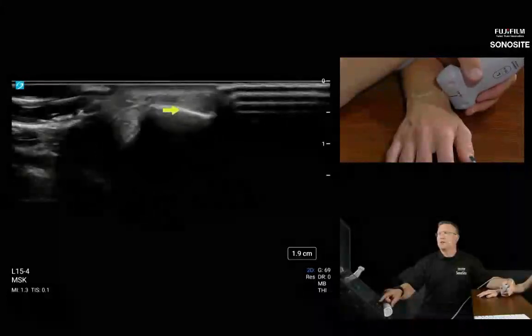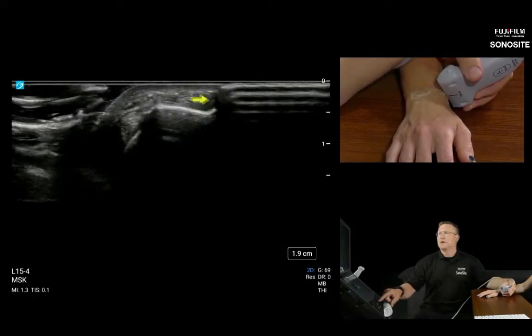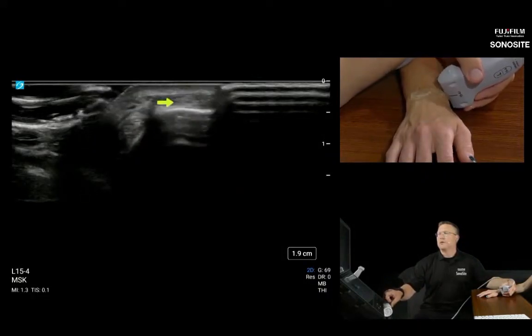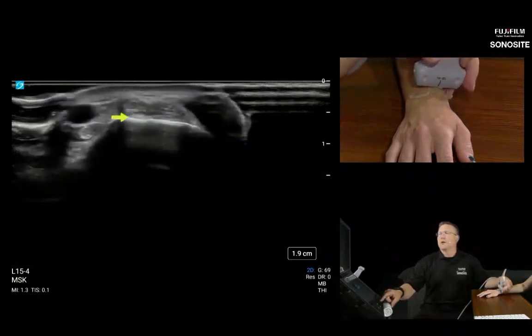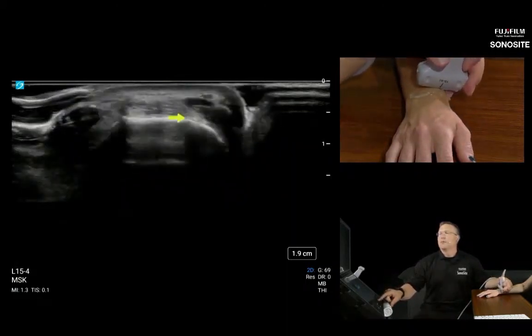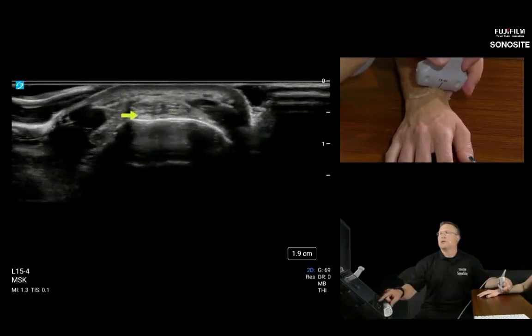Take note of the two distinct tendon slips of the APL and the EPB. They'll be a lot more noticeable with an L19. Now I'm going to roll the probe over here to the ECRs. As we talked about in the PowerPoint, we have the ECRL and the ECRB.